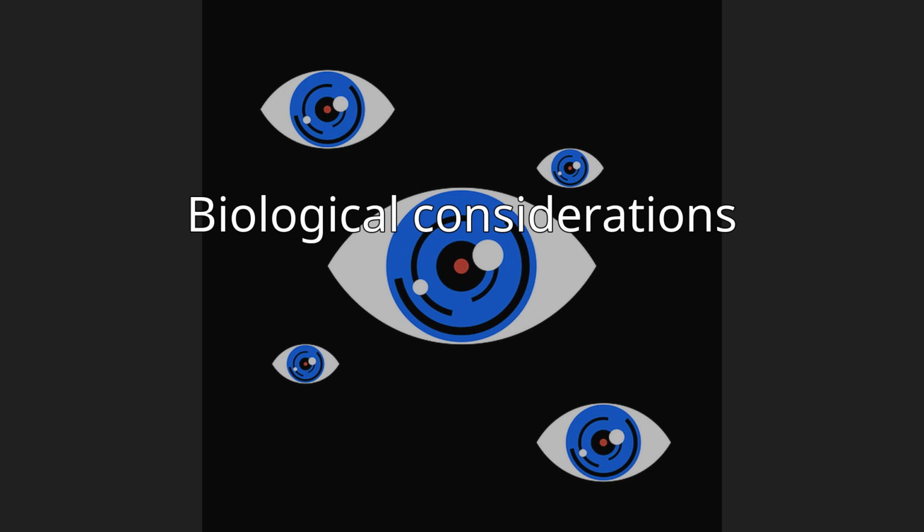Candidates for visual prosthetic implants find the procedure most successful if the optic nerve was developed prior to the onset of blindness. Persons born with blindness may lack a fully developed optic nerve, which typically develops prior to birth, though neuroplasticity makes it possible for the nerve and sight to develop after implantation.